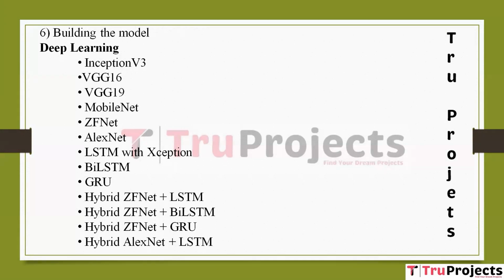MobileNet. MobileNet is a lightweight CNN architecture specially designed for mobile and embedded devices. It's known for its efficiency and low computational requirements. MobileNet may be used in this project to analyze ECG images with a focus on resource-constrained environments.